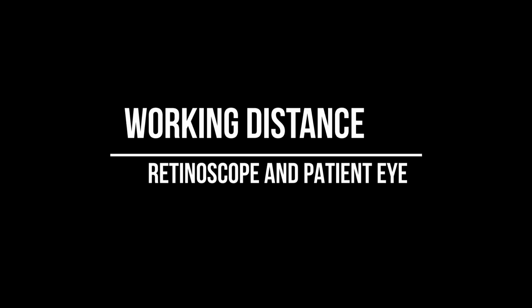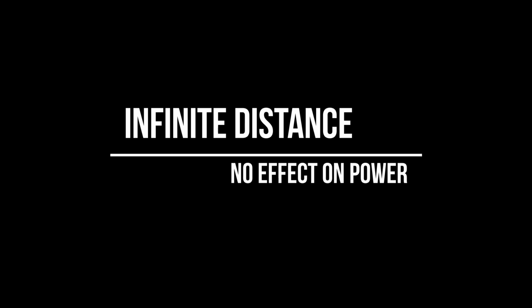Now let us look at the working distance. This is the distance between the retinoscope and the patient's eye. If the distance is infinite, for example over 6 meters, there is no need to work on the working distance. This is, however, not practically possible because it will not be possible to see the reflex, and even changing the lenses from this to this will not be practically possible.